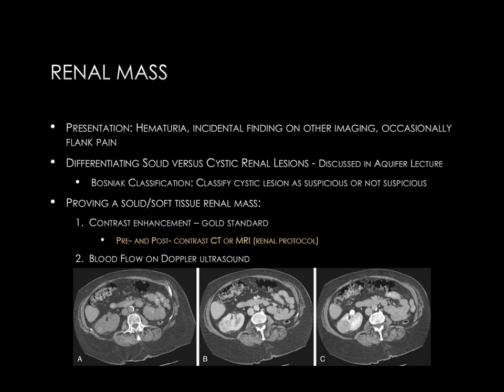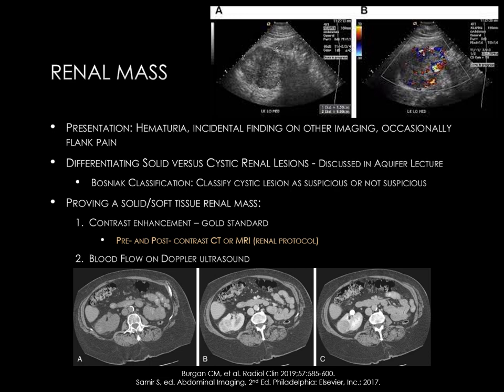An alternate, less commonly used method would be demonstrating blood flow on color Doppler ultrasound within a renal mass. There is an exophytic mass at the upper portion of the kidney. On the color Doppler image you can clearly see small blood vessels within the mass, indicating a solid mass.